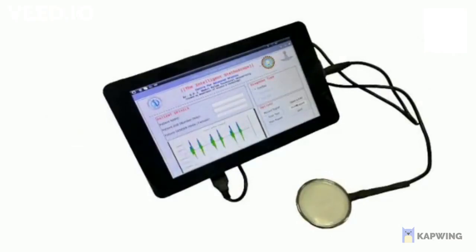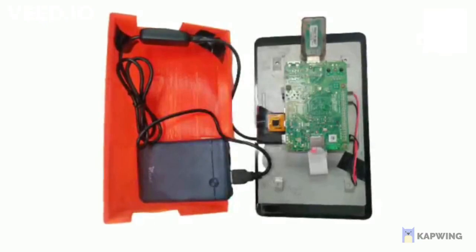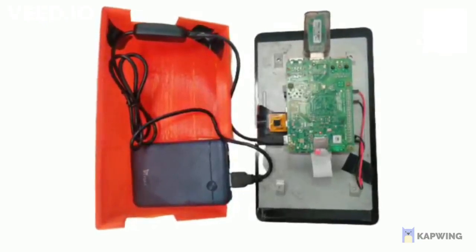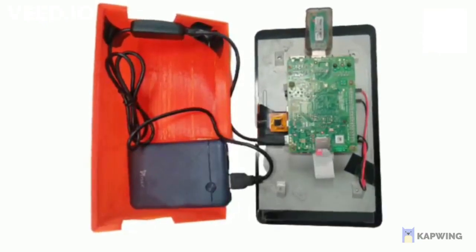The developed prototype contains a stethoscope, sound card, display screen, DSP processor, and power bank.